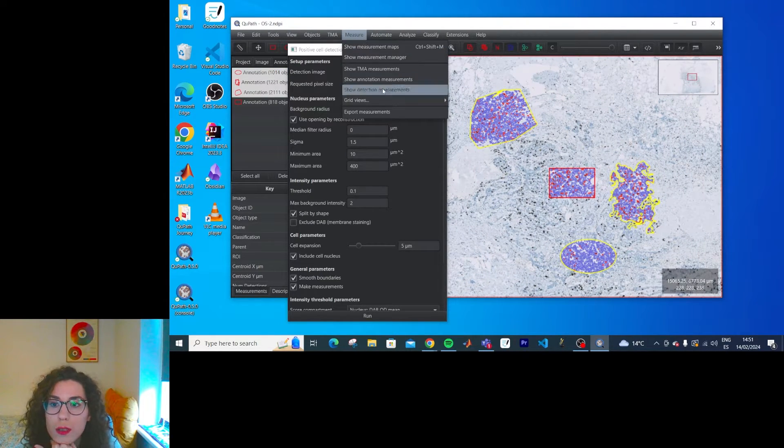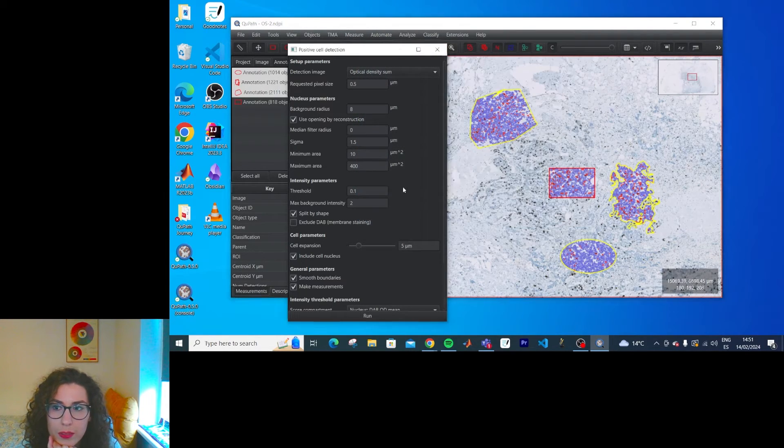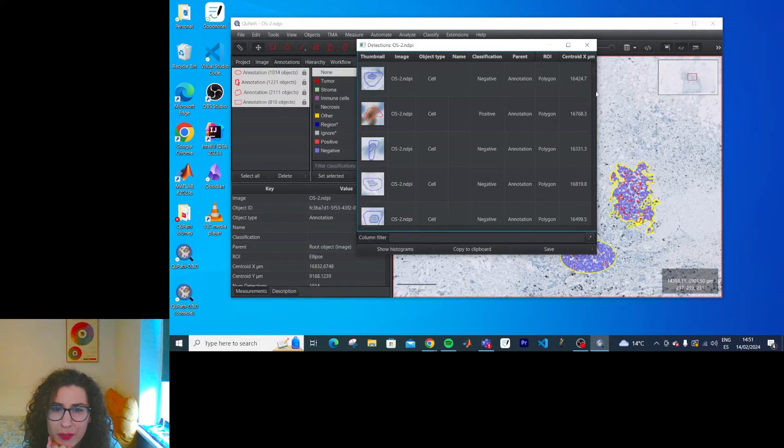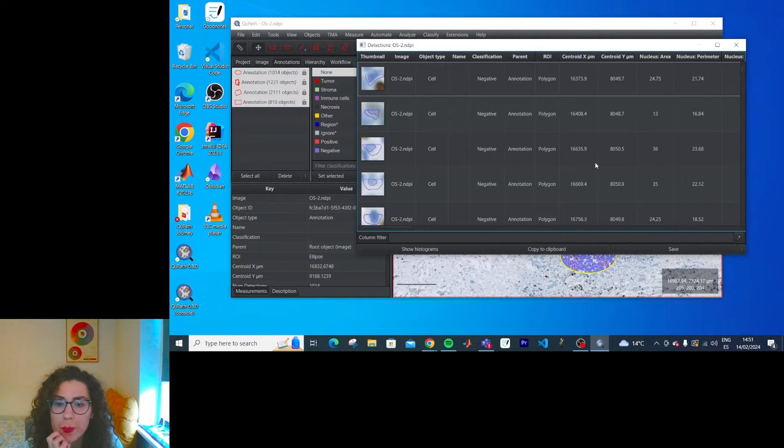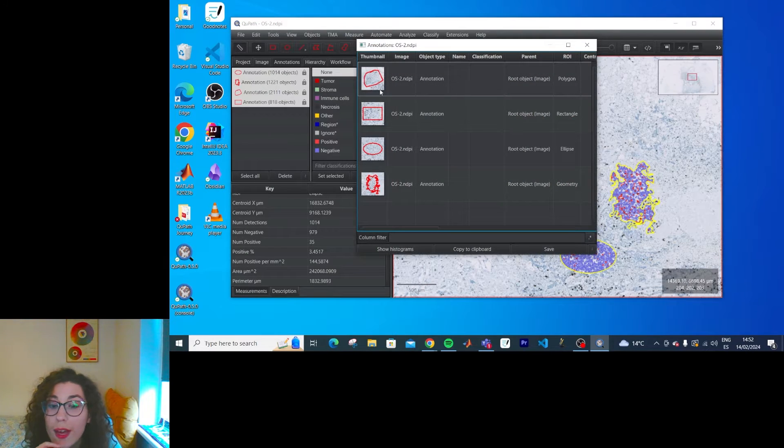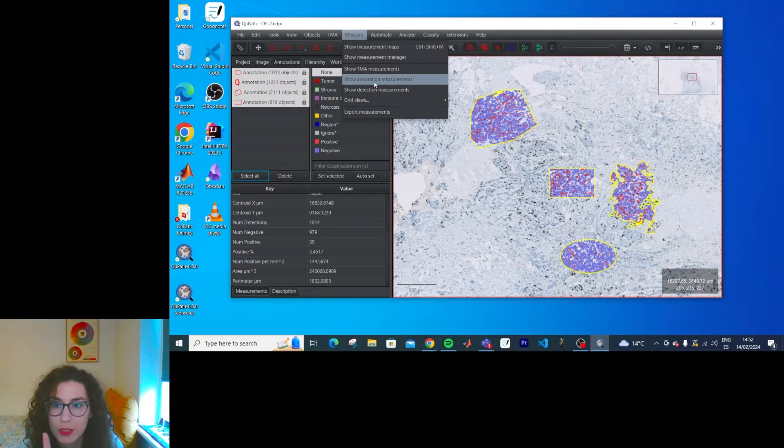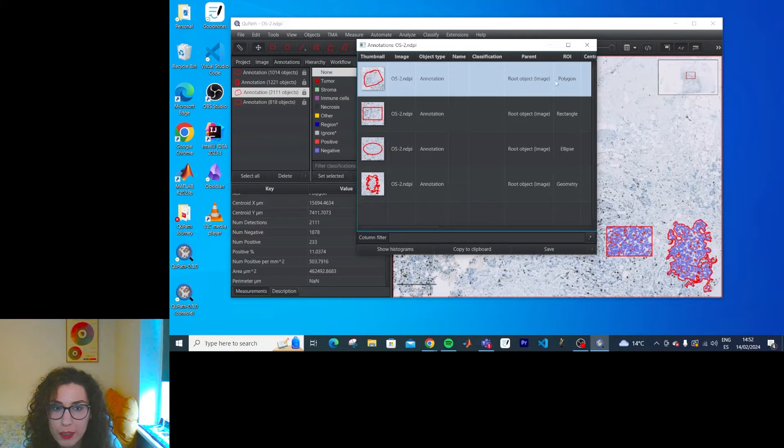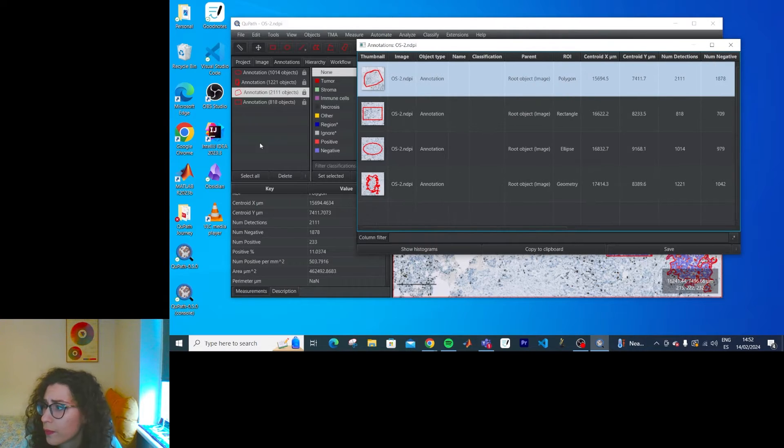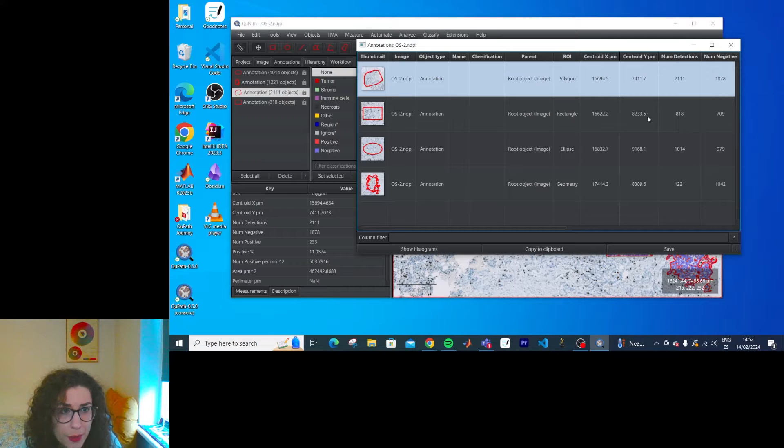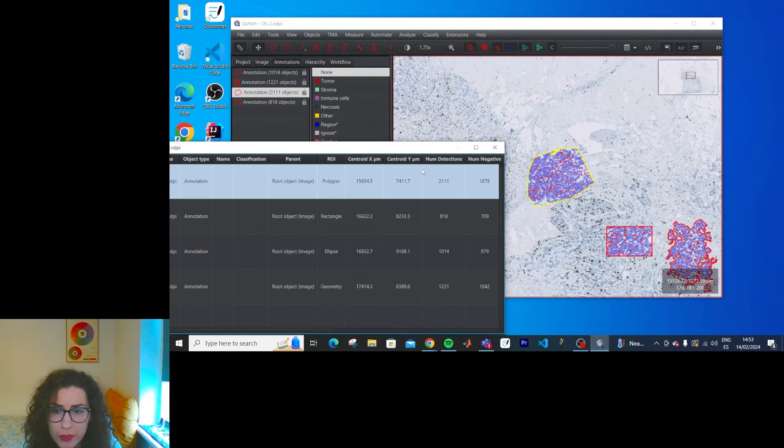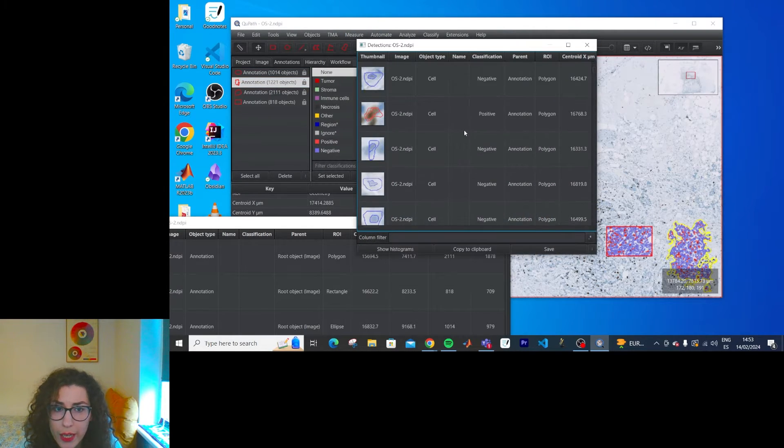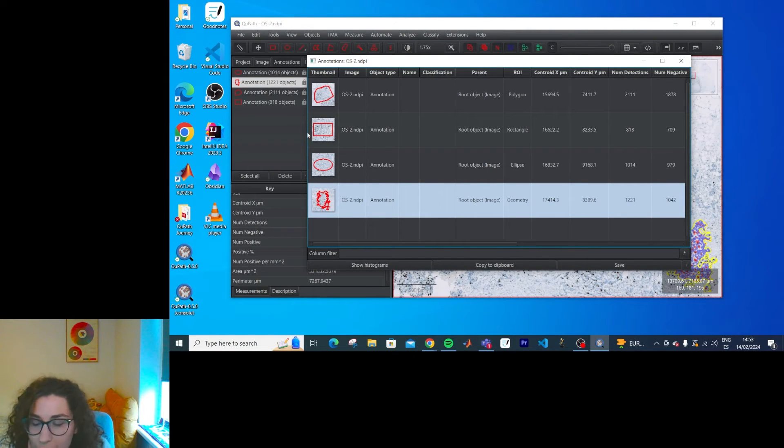And then how does this look? How does the measurements look? If I select them all. Aren't they separated or something? How do I separate them? It's a different command. So instead of show detection measurements, you need to show annotation measurements. And then presumably if you double click. Nope. If you do want, how do I know going inside that? You can't. So this is a summary. Why can't I go inside? For checking out each of them, I need to click on an annotation and show detection measurements. And I get that. I would like to be able to click and go inside that.